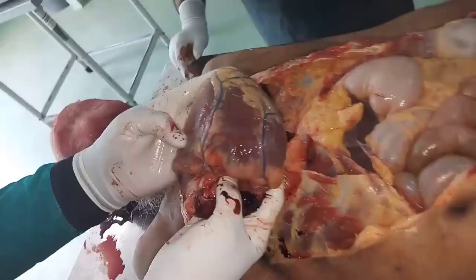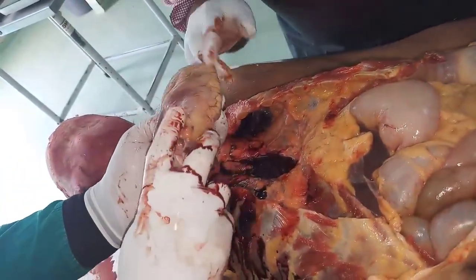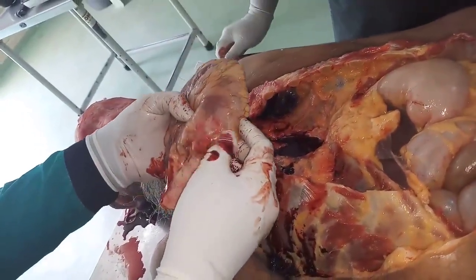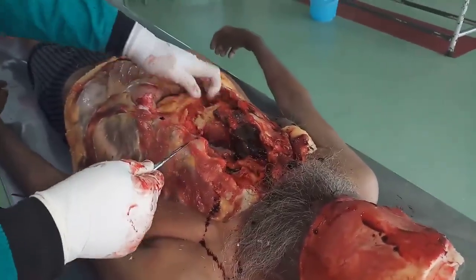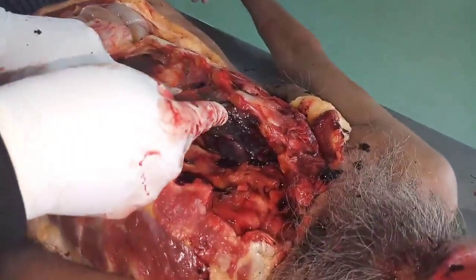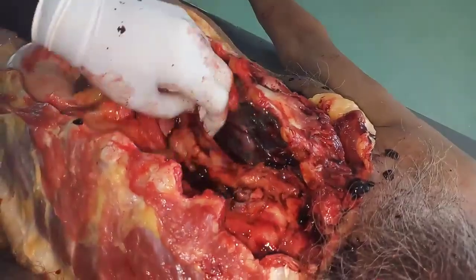So the heart is large in size. There is a white patch also, a fibrotic patch. Maybe some old MI. Most of the lung is adherent. See the adhesion. Lung is adherent.